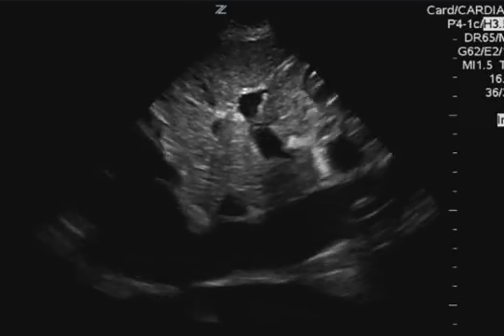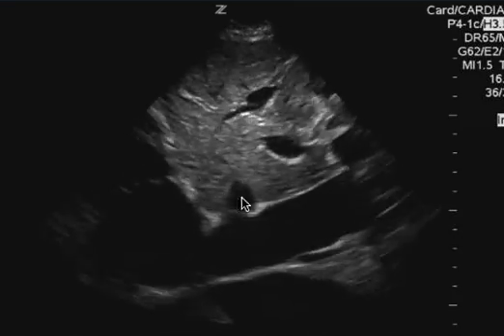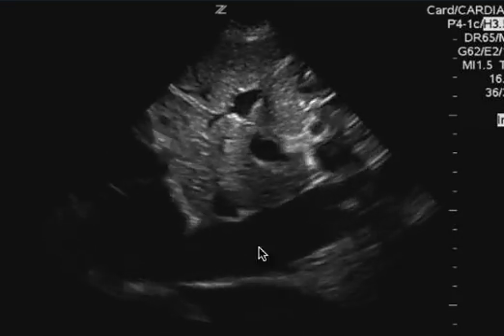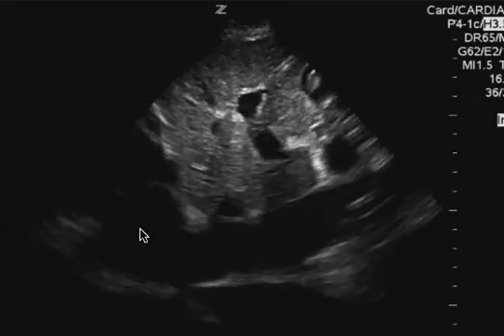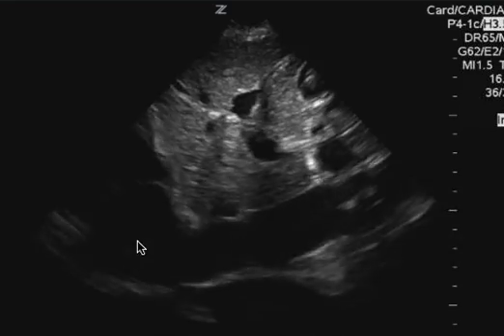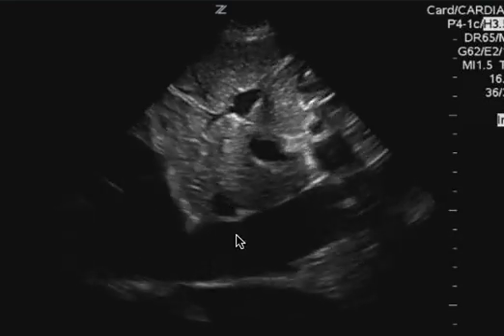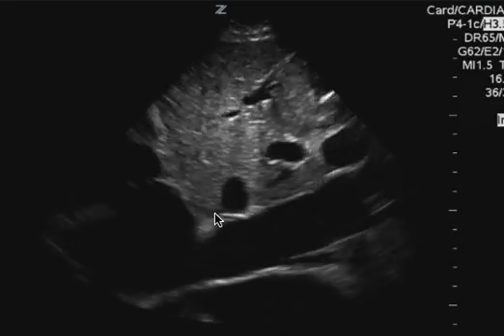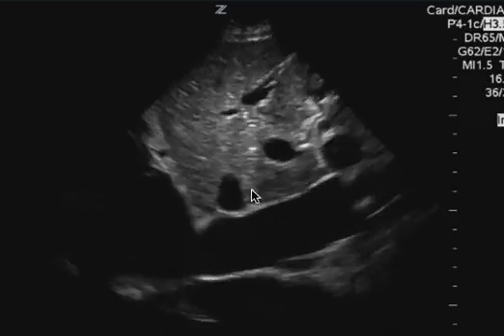This is an example of a different patient, but this shows you what I need to see. This is the hepatic vein right here, and this is the area you want to look at. This is the right atrium. So even if you didn't see the hepatic veins entering into the IVC, at least it's a good view of where you can see everything.